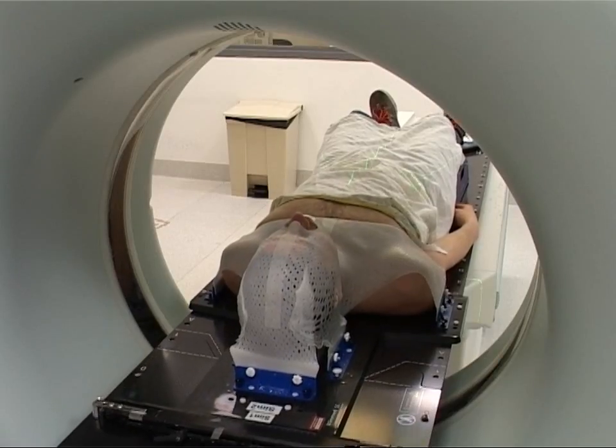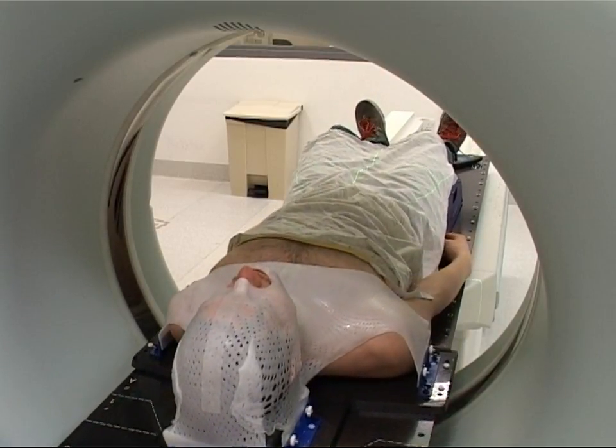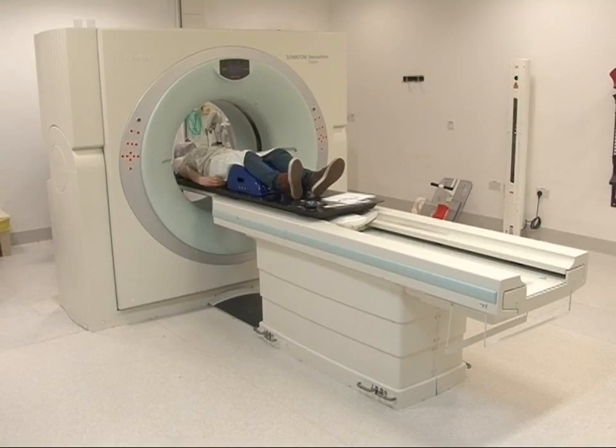The radiographers have to leave the room for the scan, but are watching you very carefully throughout. The scan itself only takes a few minutes.